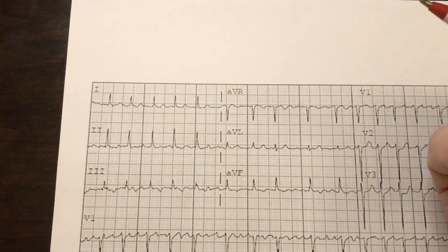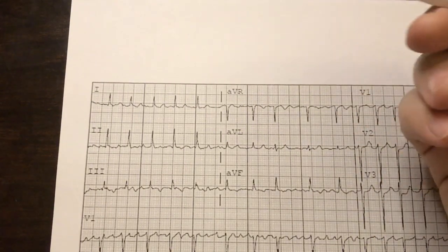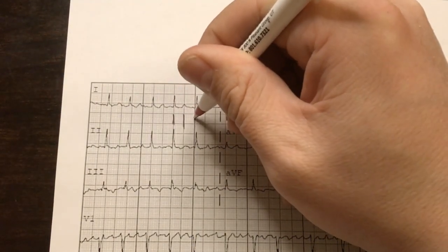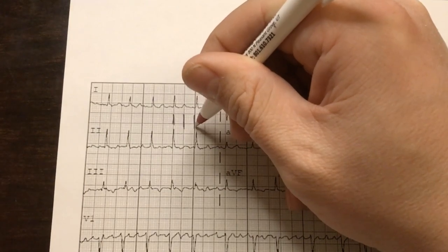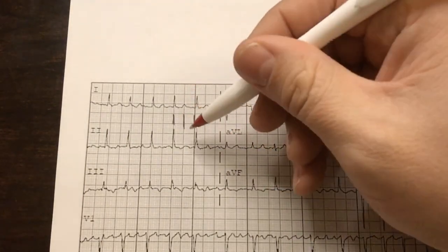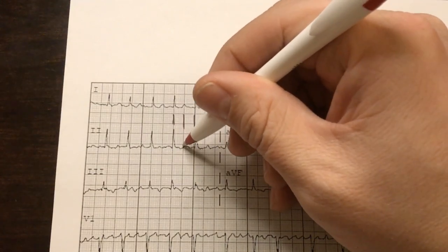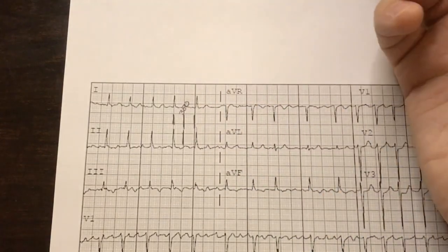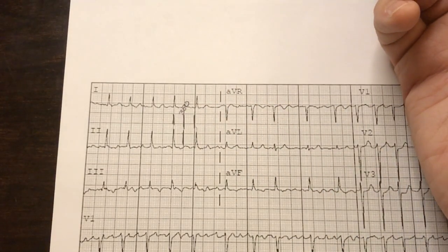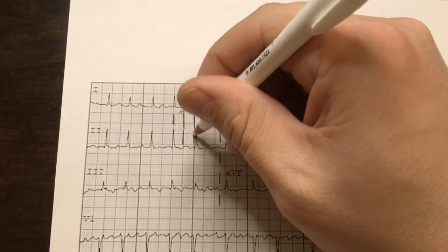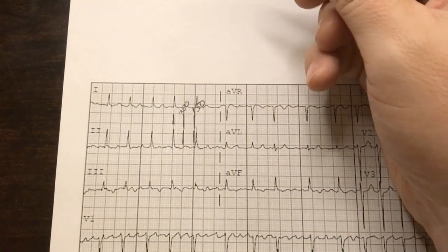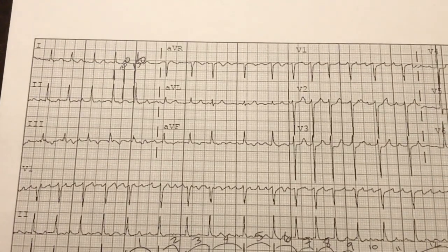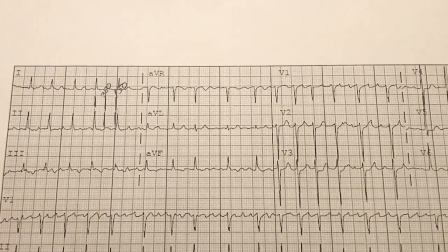One more quick example. Let's go ahead and use this regular rhythm. This QRS happens to land right on a dark line: 300, 150 — this happens to be just below it. Now if the next R-wave landed right here on the next big box, then this patient's heart rate would be 300 beats per minute. If it happened to land right on the next box we would say 150. Hopefully that makes sense how you can use the big box method to determine the patient's heart rate if they are in a regular rhythm.